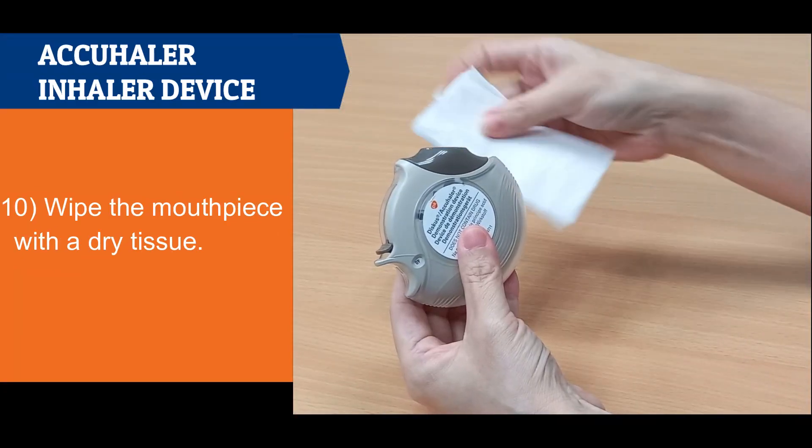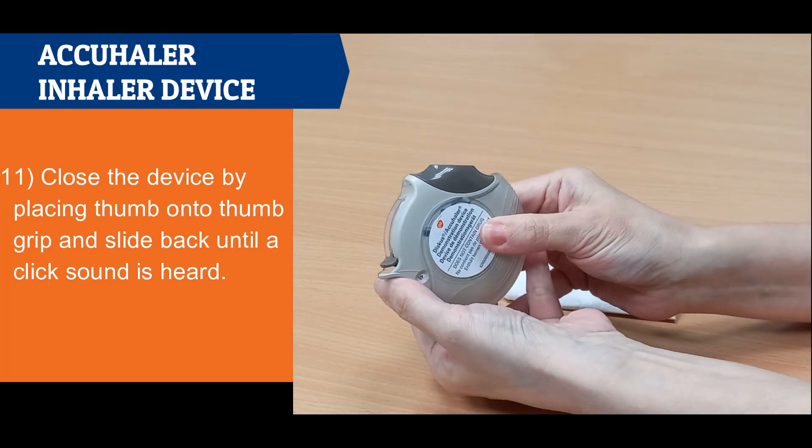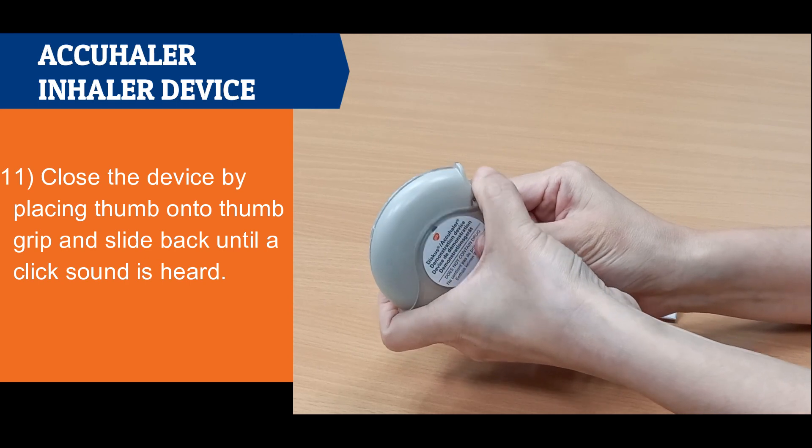Wipe the mouthpiece with a dry tissue. Close the device by placing the thumb onto the thumb grip and sliding back until a click sound is heard.